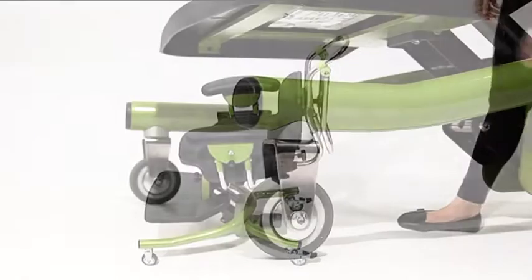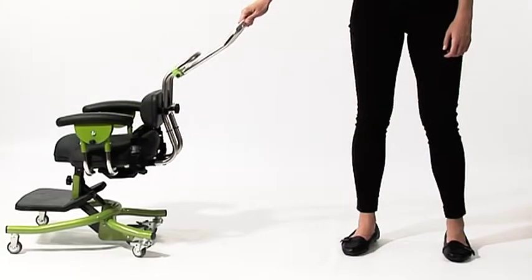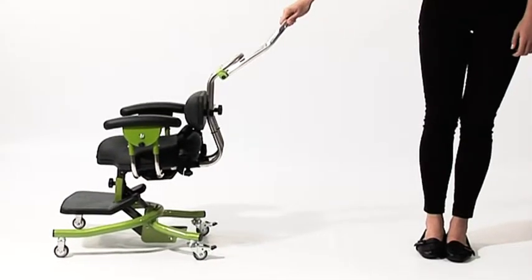The Strato has fixed front casters, which relieves the need to reach under the table to lock them. The easiest way to manoeuvre the chair is to pull backwards for long distances and to push forward for short distances.